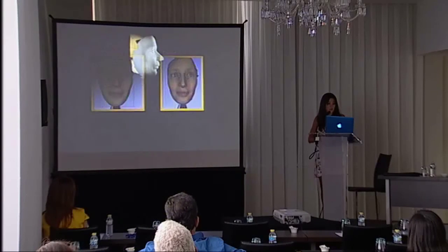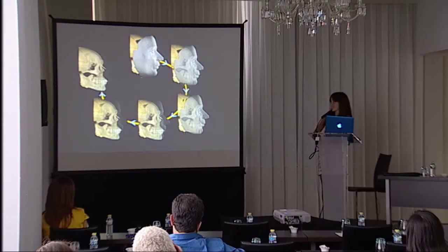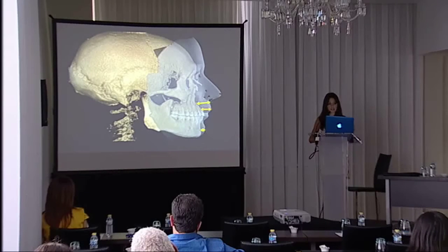But also, when combined to the CBCT, the facial scanning has the potential of giving the hard tissue, soft tissue relationship, and that's by simply adjusting the contrast and the intensity of the facial soft tissue. We can then see the underlying bone. This is very important because we can then, for instance, see the tooth-lip relationship, or, if needed, measure the thickness of the soft tissue at the subnasal point, labial area, or chin.